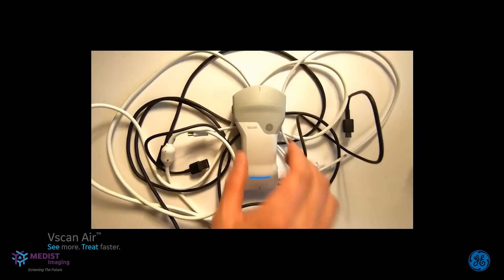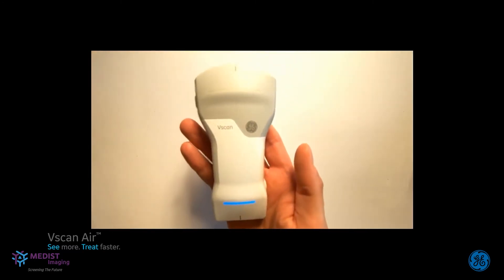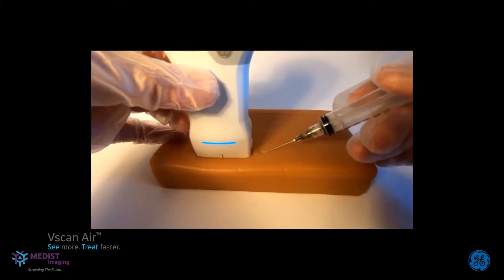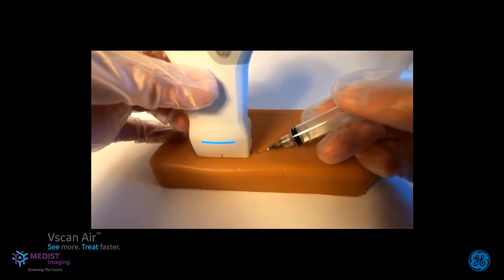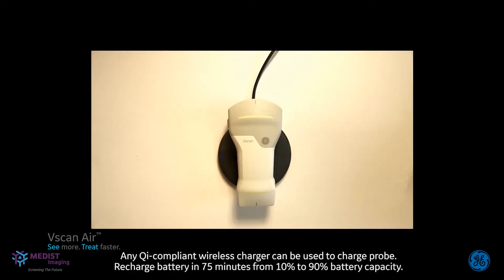The cable-free, wireless design is intended to provide flexibility in maneuvering the probe across different body parts with ease and provides an ergonomic advantage, especially during procedures. There are no hassles from bent or broken cables, or risks to breaking the sterile field during guided procedures. A disposable probe cover can also be used.